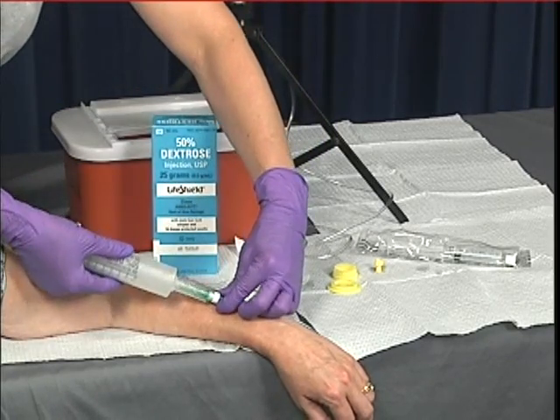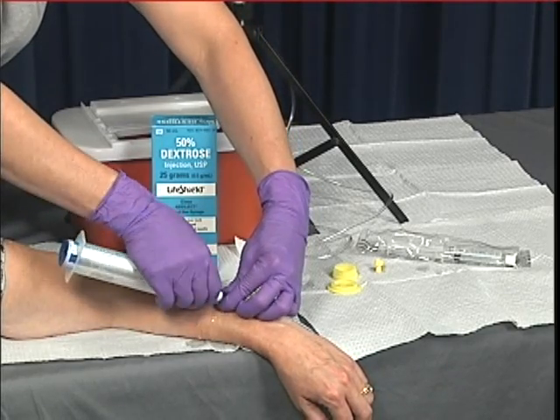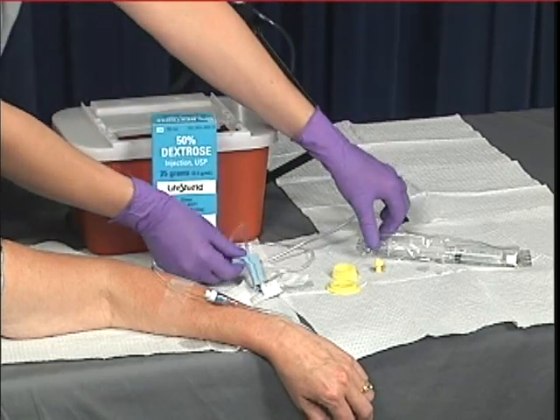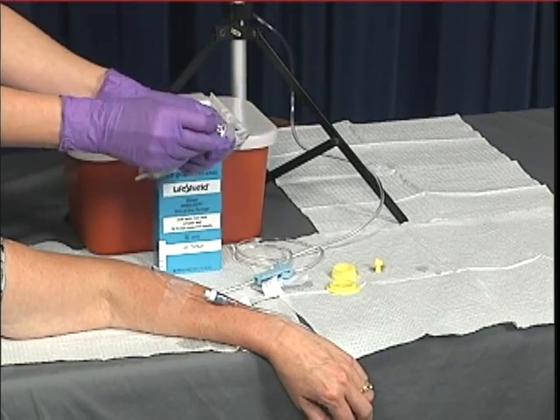Disconnect the syringe from the med port. Following the injection of the medication, flush the IV by opening the clamp or use a normal saline flush.